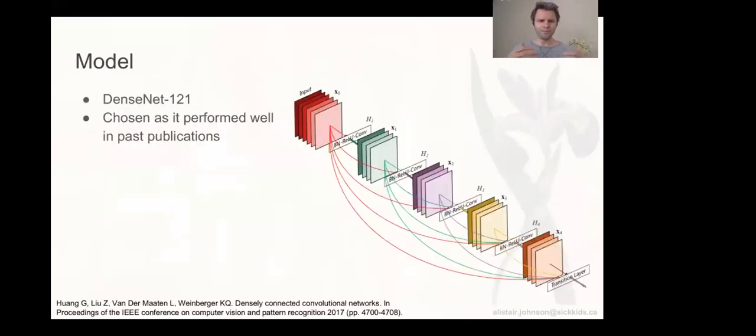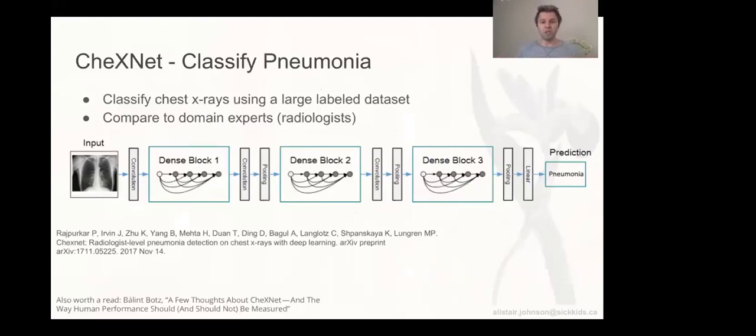Now we need some models. I won't get into the details of computer vision. There's a lot in this conference which does a better job at explaining recent advances than I could ever do. But we're going to use a DenseNet here. When people were trying out a few different models, DenseNets seemed to work fairly well. So most chest X-ray models are based on a DenseNet architecture. But I don't think it's particularly important to consider only this architecture, and I'm sure the lessons hold for other architectures as well.